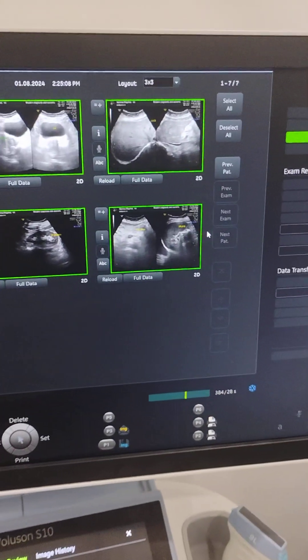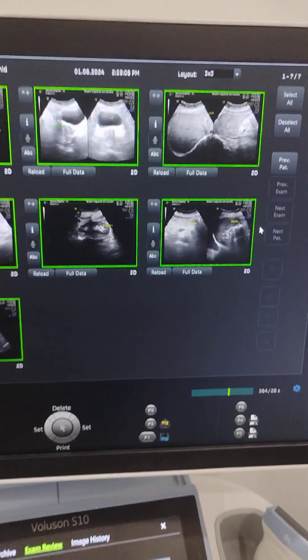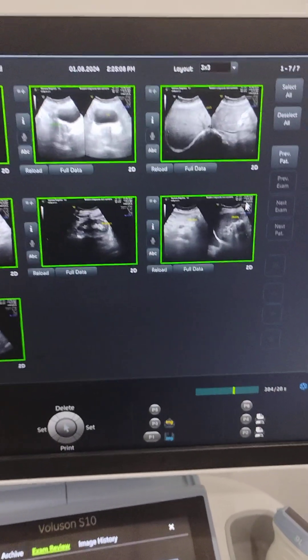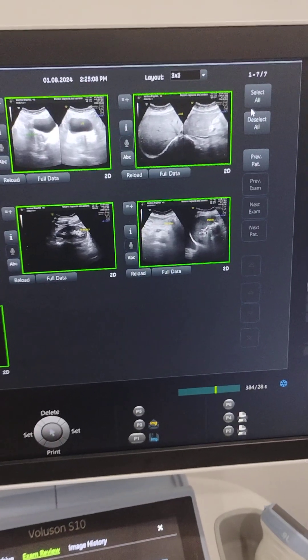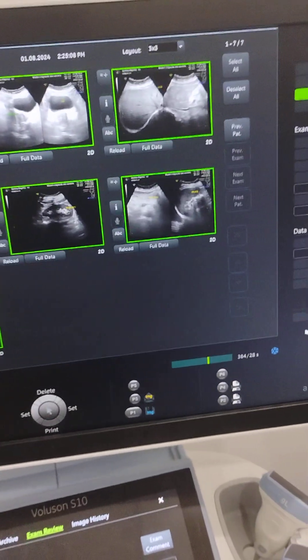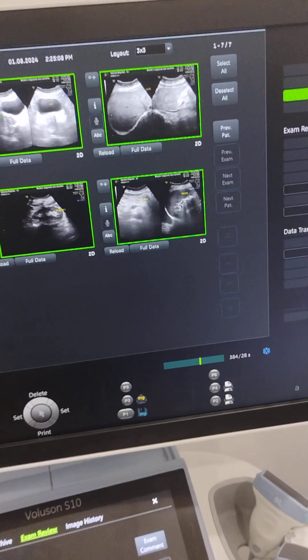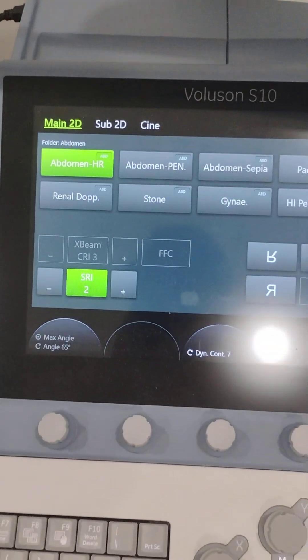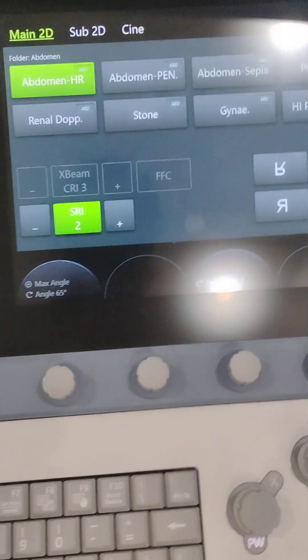Sometimes the doctor takes more than 6, 8, or 9 images. You just have to deselect if there is any image which is to be deselected, and then you just exit. This is the ultrasound machine — there are different functions and functionalities.